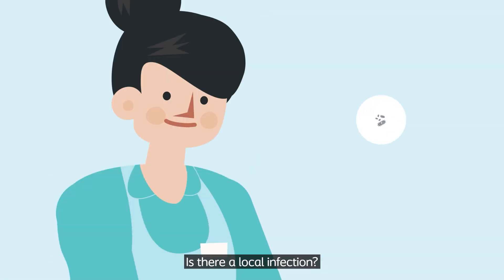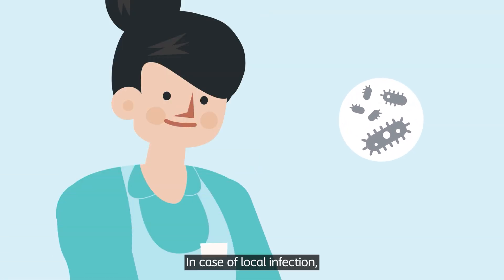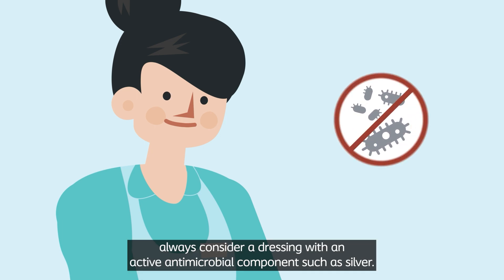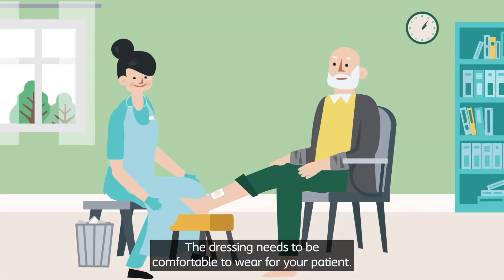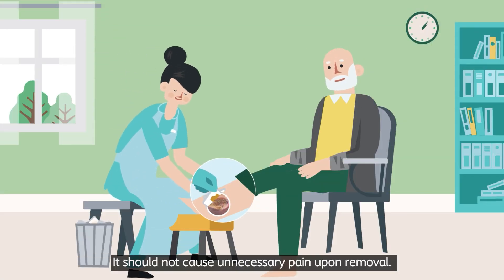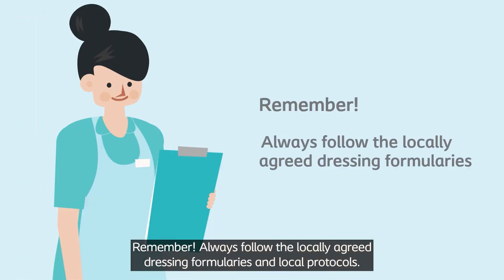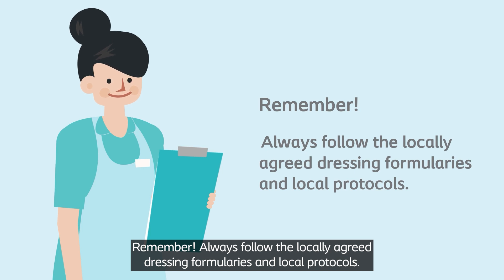Is there a local infection? In case of local infection, always consider a dressing with an active antimicrobial component, such as silver. The dressing needs to be comfortable to wear for your patient and should not cause unnecessary pain upon removal. Remember, always follow the locally agreed dressing formularies and local protocols.